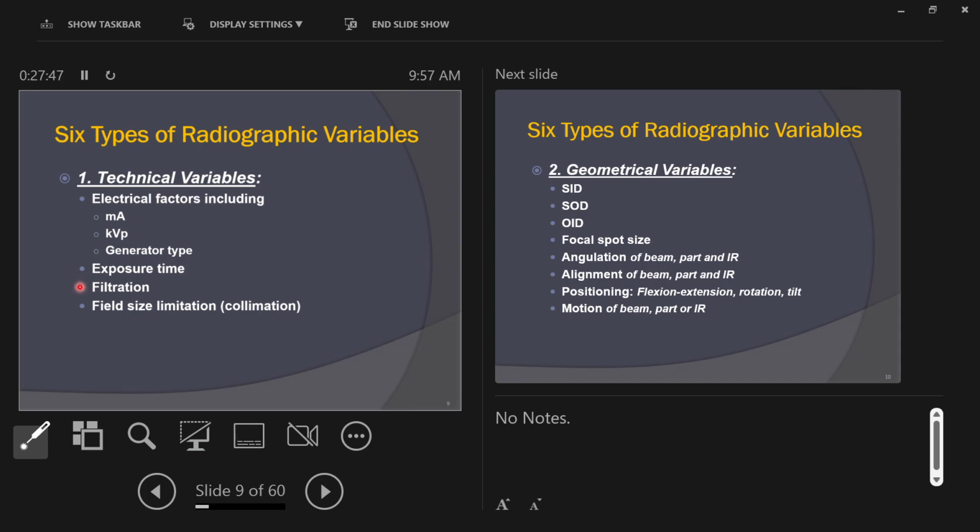In X-ray, we don't want the low energy stuff. We would like to filter out the low energy stuff because in radiography, the low energy radiation stays in the patient, doesn't pass through the patient, and is therefore non-diagnostic. It doesn't give us any information. It just sticks in the patient and adds to their exposure.